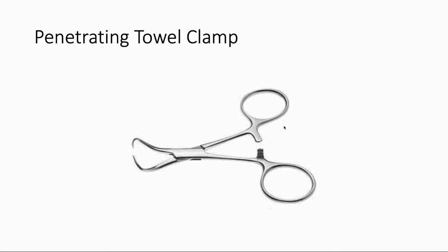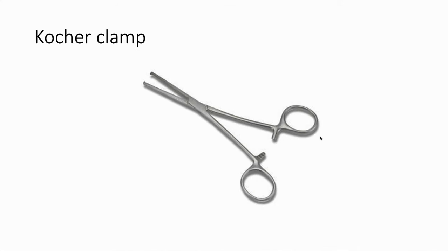Here we have a penetrating towel clamp — it looks like a diabolical device with really sharp pincher-looking things at the end. These are usually used to hold towels in place after draping, and you'll often be helping take these off the towels at the end of the case. This is a Kocher clamp — the big, heavy-duty version of our clamps. It's bigger than most other clamps, has teeth on the ends, and we use this to grab big, hardy structures like the abdominal fascia when closing. It's frequently just referred to as a Kocher.